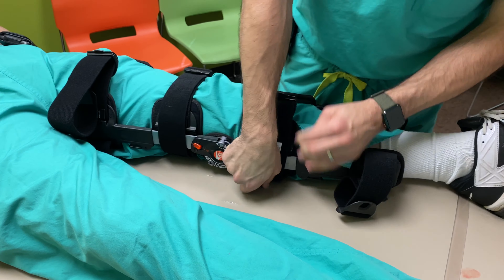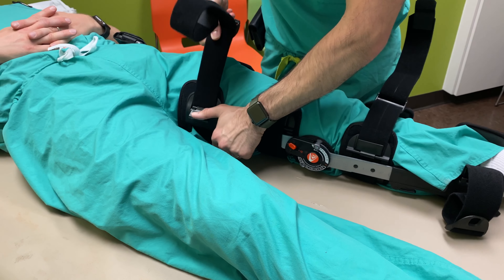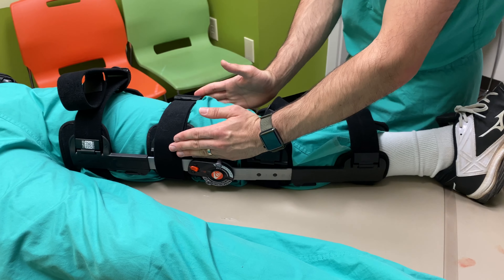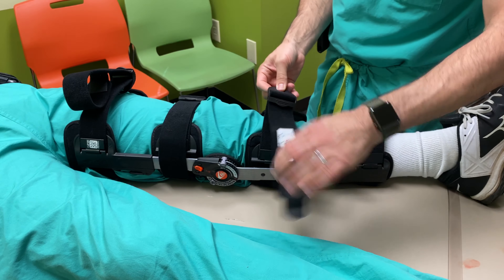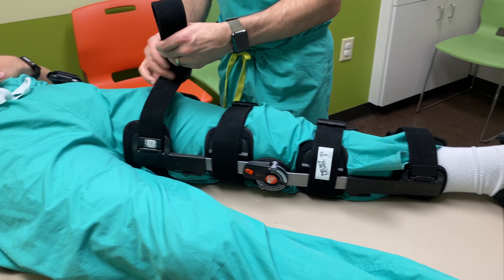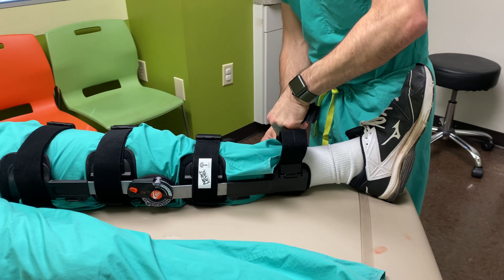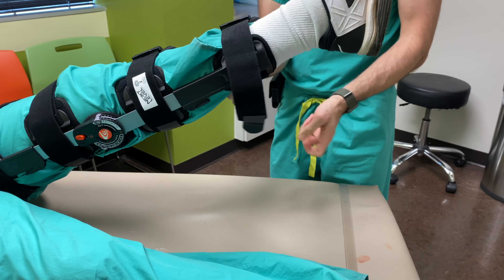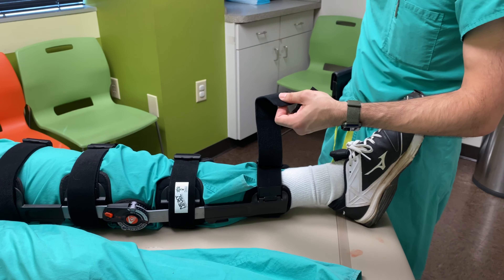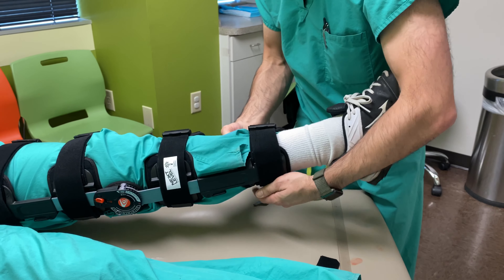Once I've done that strap to anchor, I'll go below the knee and take the slack out, followed by the very top strap, and lastly the very bottom strap. This is the easiest way to maintain the proper position at the knee. Once you've got that situated, take the remaining clips in that same order — clip it to the other side, pull the slack out of the front, and attach towards the back of the brace. Note that sometimes when you pull the strap tight, it doesn't attach to fabric but instead attaches to plastic. In that situation, take this tab off, fold it or cut it, reattach the velcro tab, and now you can attach the brace appropriately.